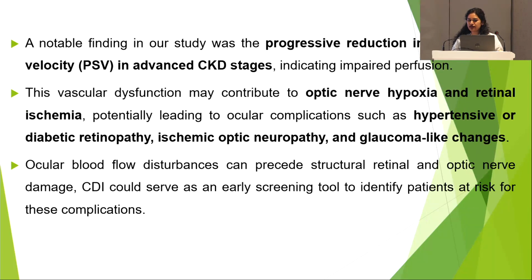The notable finding of this study is a progressive reduction in peak systolic velocity seen in advanced CKD stages. Optic nerve hypoxia and retinal ischemia are seen, which may potentially contribute to further complications, the ocular complications such as hypertensive and diabetic retinopathy, ischemic optic neuropathy, and glaucoma-like changes.